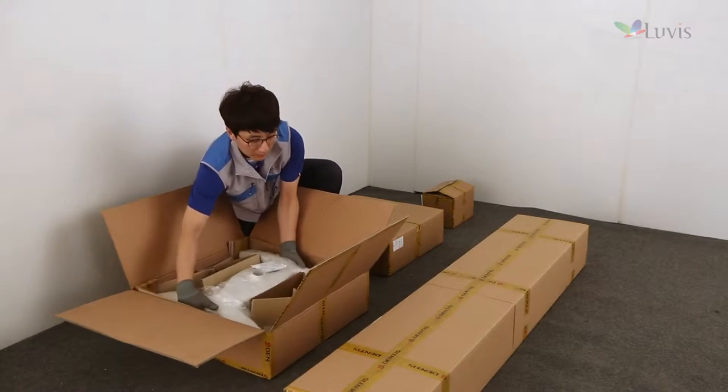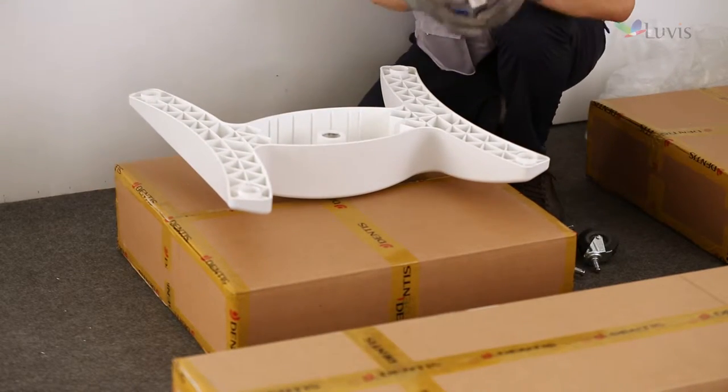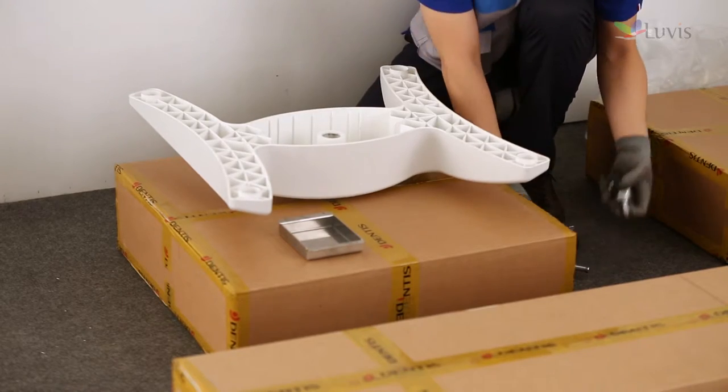Open the base body box. Take out the base body and check it for any damage. After that, turn it over and place it on the floor.